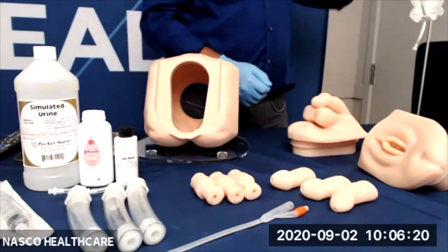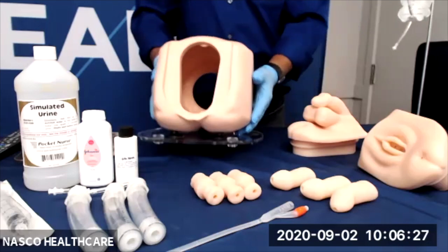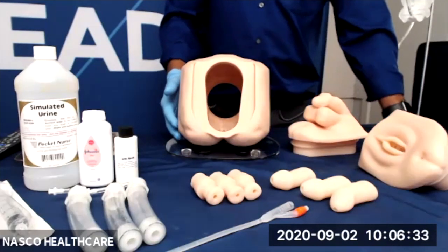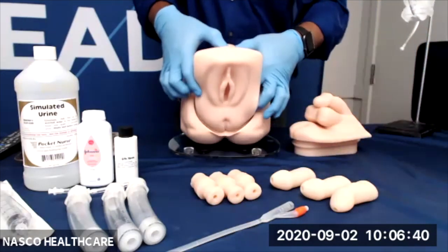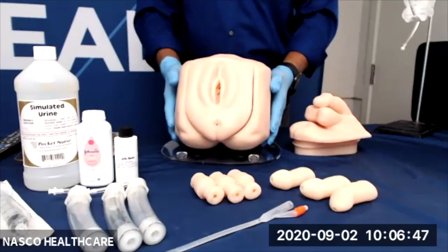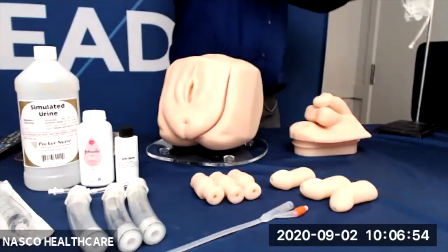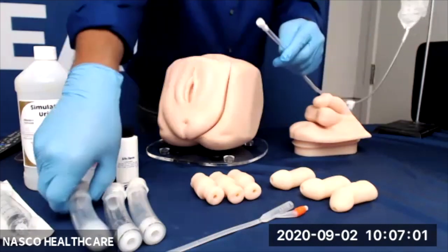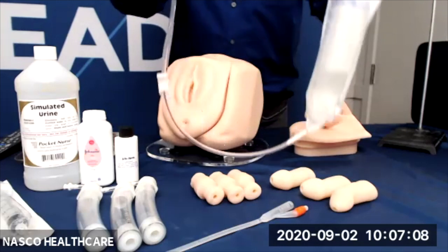Let's take a look at the catheter setup. We will begin by removing the housing from the carry case — Khaled has already done so. Next, we will insert the genital into the housing unit. When you are doing this, you will notice that it fits nice and snug. Ensure that the clamp on the fluid supply bag is closed as you attach the tubing lure on the end of the fluid supply bag to the swiveled lure on the bladder.